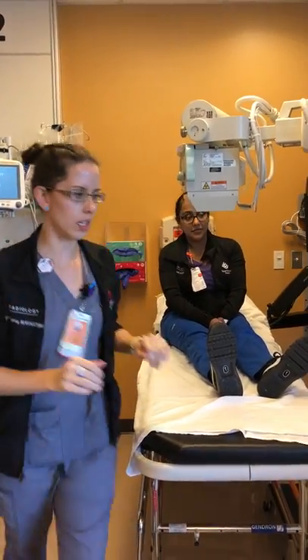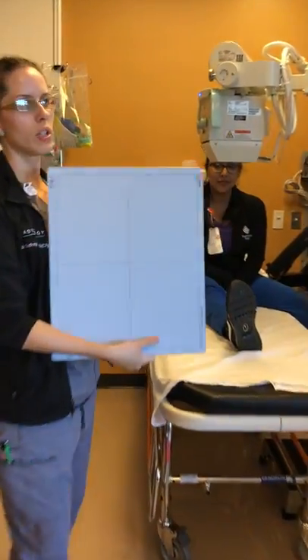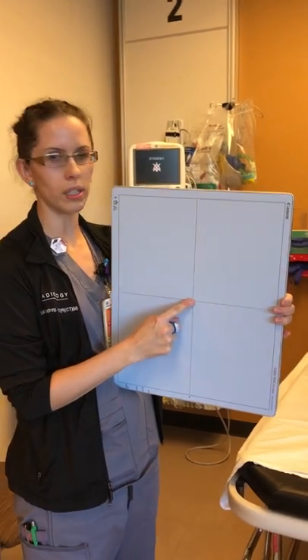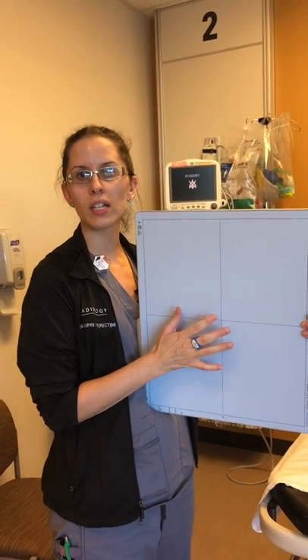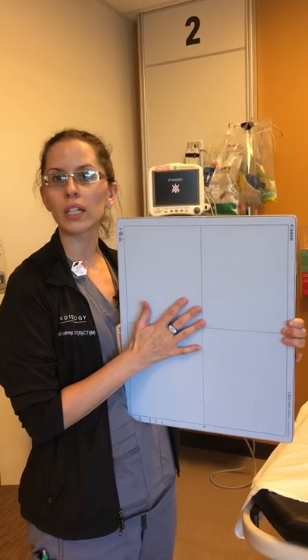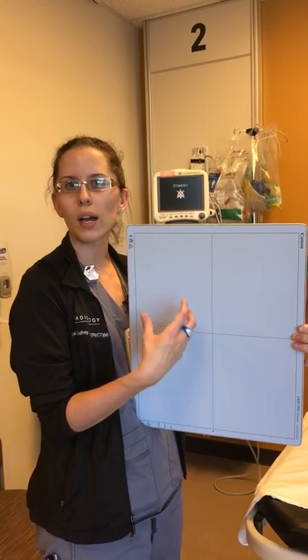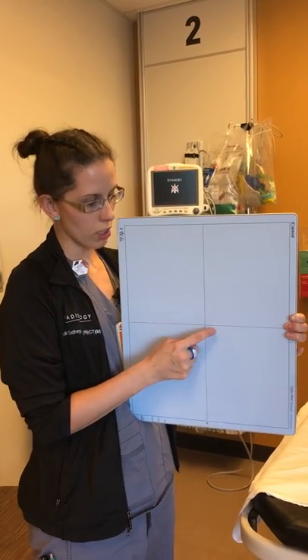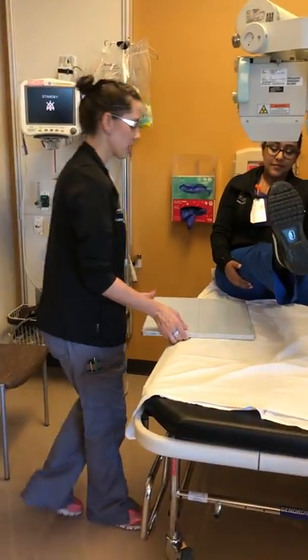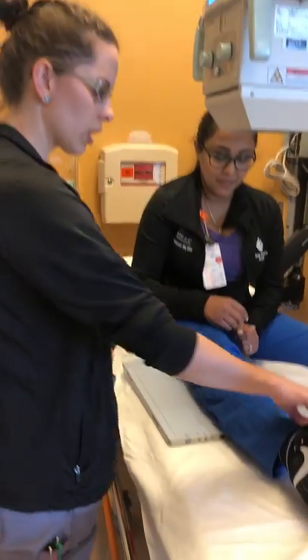We are going to take an x-ray of her right knee. It's very important in centering any patient on any x-ray — if you can possibly put them in the center of the detector, that's going to help with your overall exposure for the best images possible and a more adequate read for penetration. So I'm going to place the detector up and under her knee.